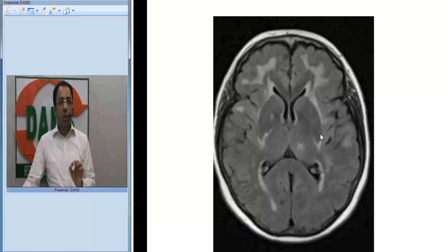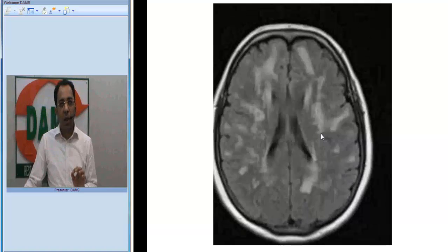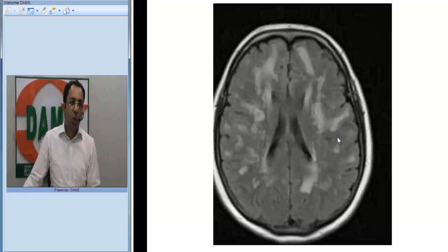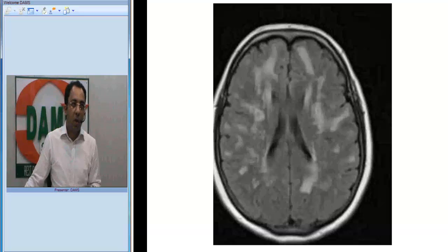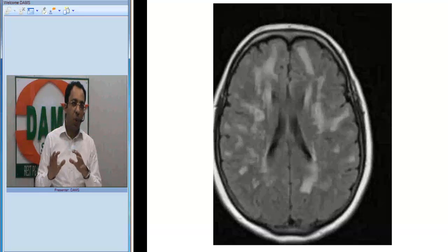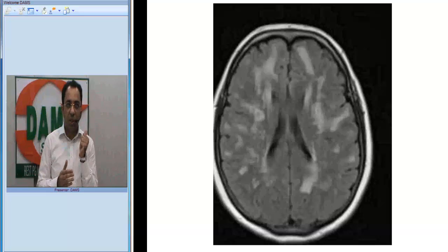Going a little higher up, you can see confluent subcortical periventricular white matter abnormalities more in the frontal lobe. So looking at these MRI findings of subcortical white matter abnormalities and external capsule involvement, combined with anterior temporal lobe involvement, brings us to a key diagnosis.